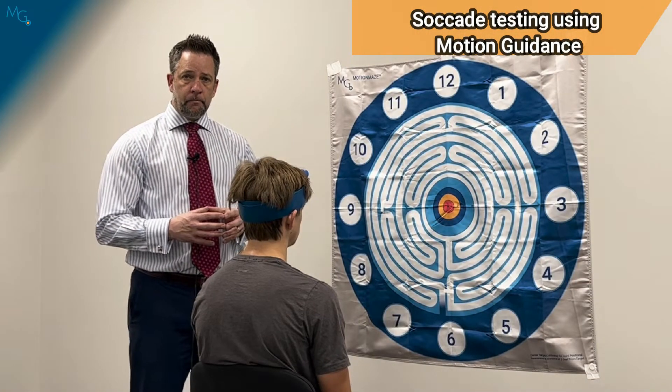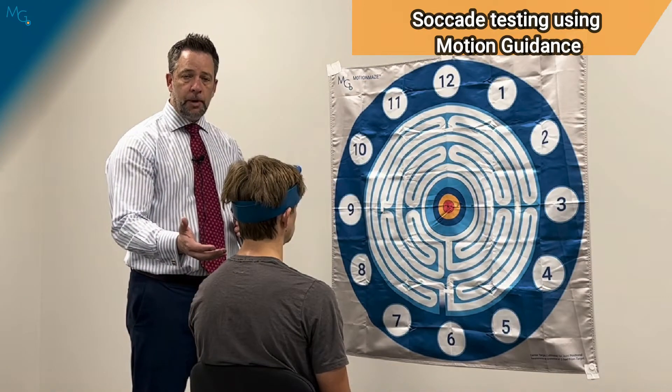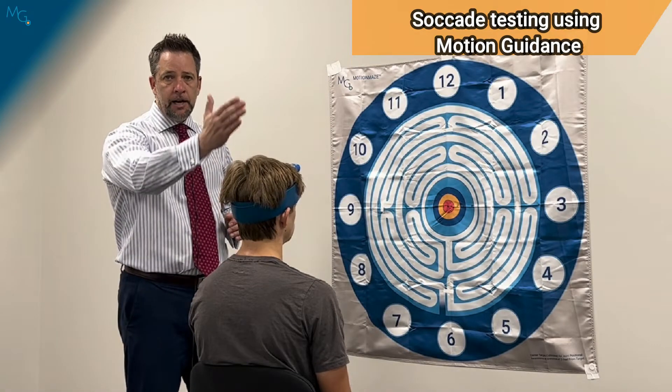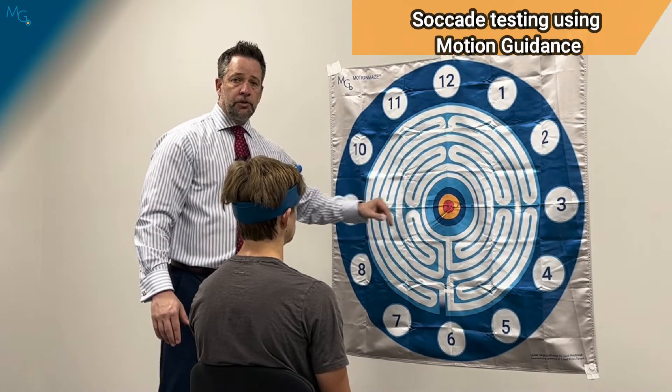Let's go over the setup. Your patient is going to be positioned three feet from the flag in a nice, comfortable, upright posture. The three feet is measured through the midline of the frontal plane of the head, and they are going to be looking at the bullseye of the target.